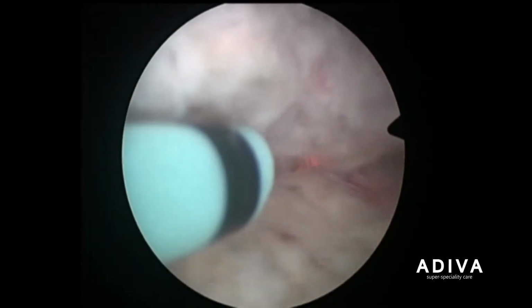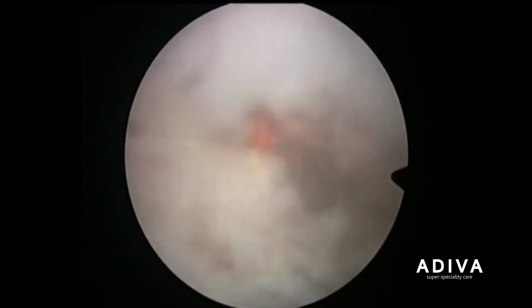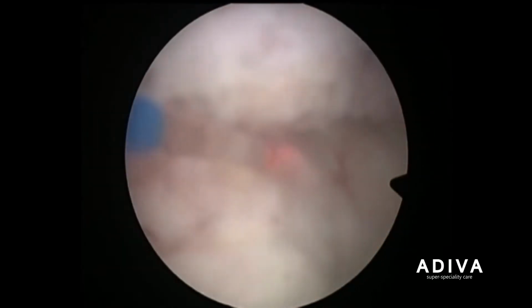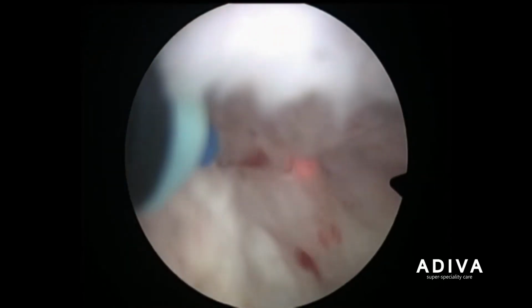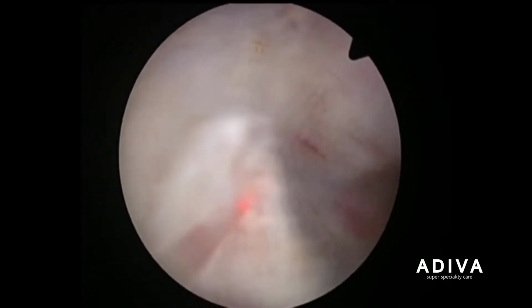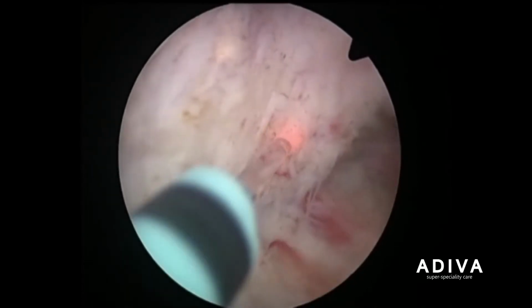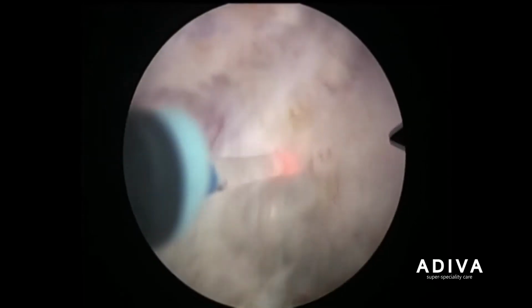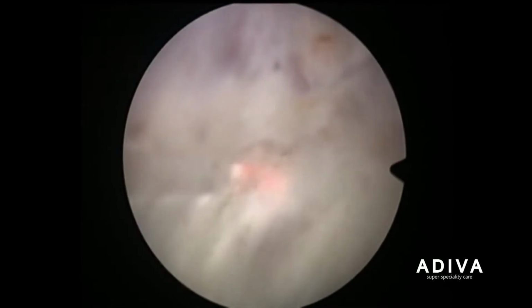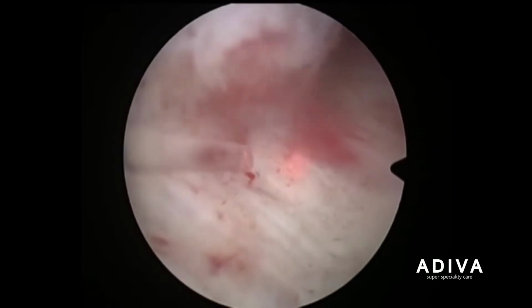The red light, the red glow which you are seeing, is an indication that the laser beam is falling here, and you can see the laser fiber which is white in color and has a color code of blue over it. It is passed through a ureteric catheter and you can see how the gland is nucleated. Enucleation of these glands is gradually performed keeping a right plane. So now what you are watching is a right plane where the adenoma or the gland is lifted away from the capsule.